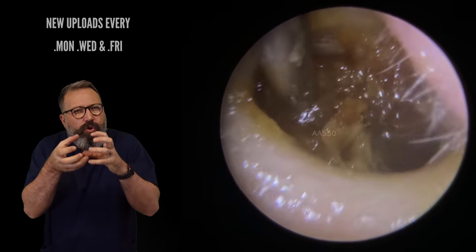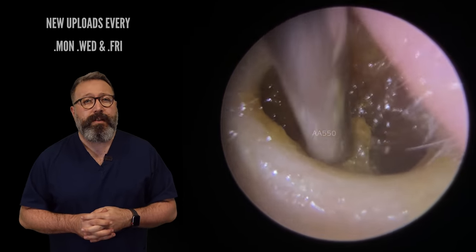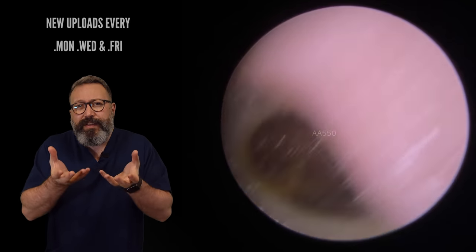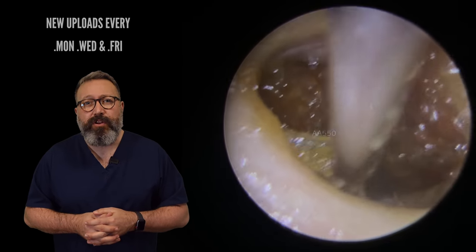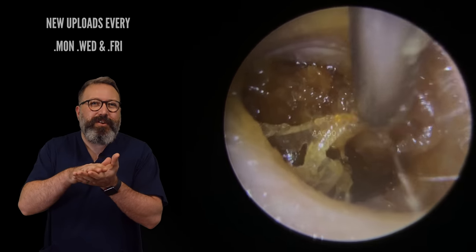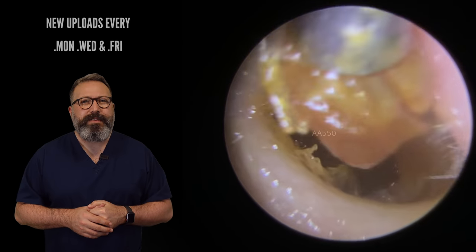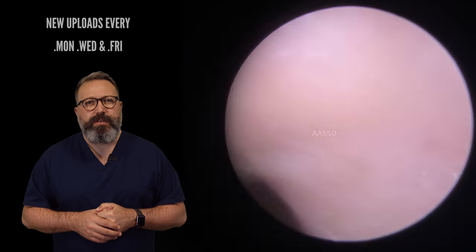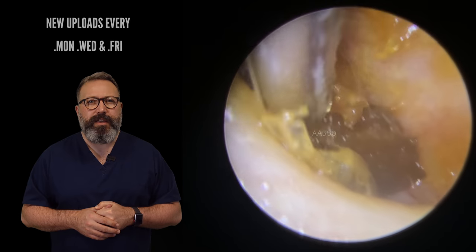There will be a kind of hard core of wax in here somewhere, so we're going to work our way very slowly down to that now. Just tidying around the edges. You can see a little lift of dead skin there at the base of the canal as well. That happens quite a lot when a patient's been using a lot of olive oil — it almost over-moisturizes the canal wall and you get this kind of separation of the skin layers. So just trying to tease this down the canal. It's very messy in here. You can see there's a lot of very liquid wax in there as well. Nice little bit coming away — let's see if we can get a grip on this central section here.